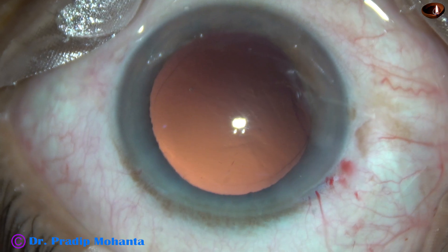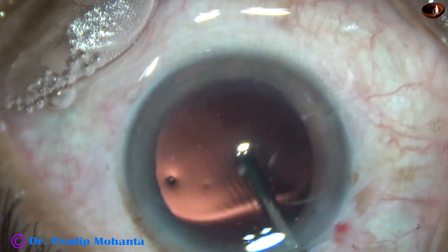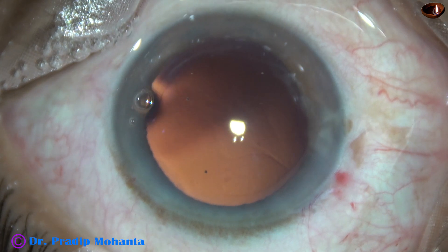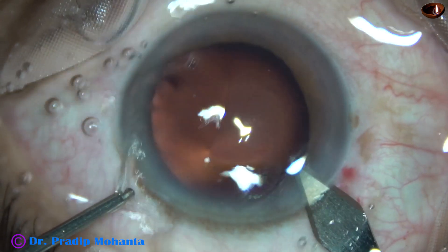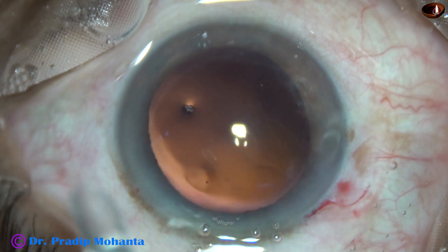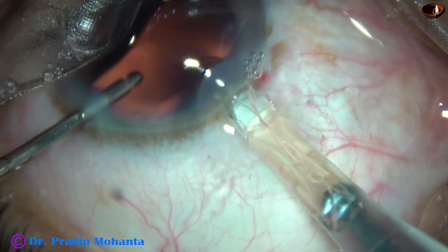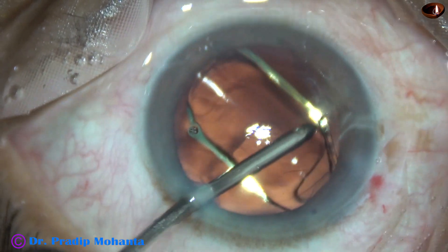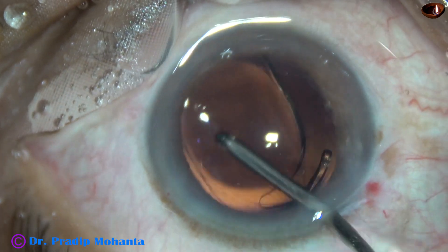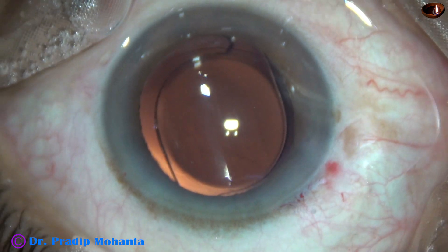In this case, we have selected a hydrophobic acrylic single-piece monofocal intraocular lens. Let us observe the hydroimplantation. I am enlarging the main incision a bit because I am going to use a B cartridge. The lens goes into the anterior chamber and into the capsular bag — both haptics go into the capsular bag. And now it is done.